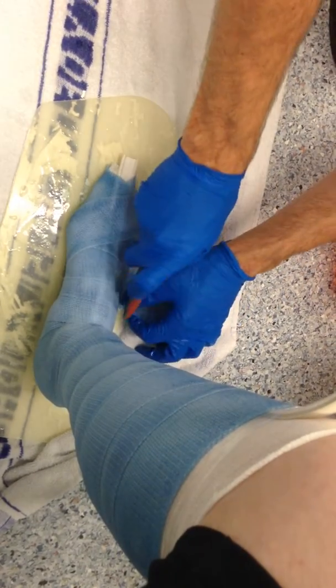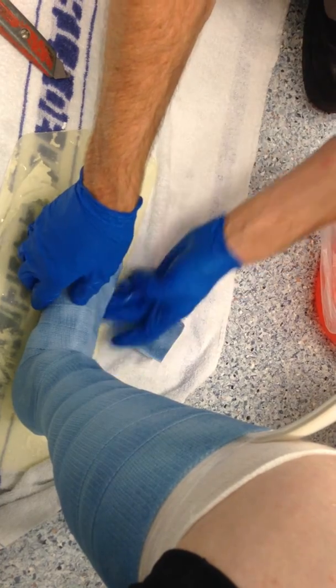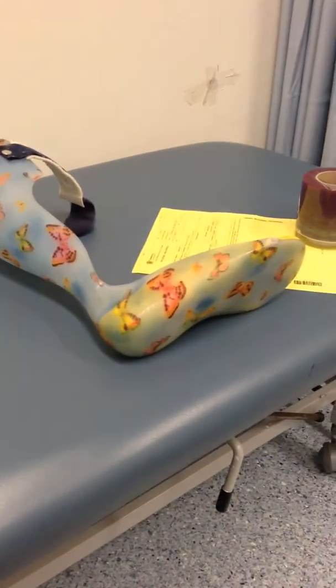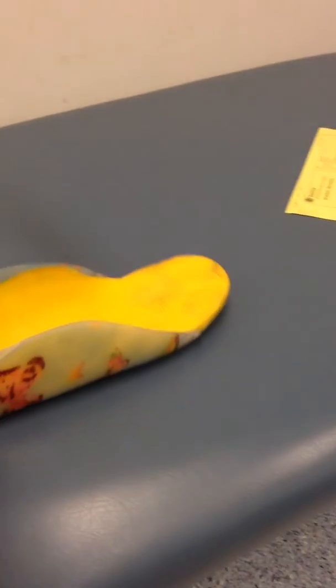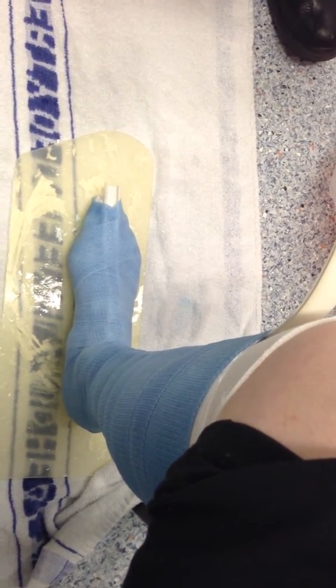Just hold that there. So this one — I don't know if we used this last time. Go right down the middle. People freak out when they see the blade — they're like, what are you doing? I still want my leg! Everyone wondering at home what I used to wear — well, this is what I'm currently wearing. The wonderful people here at orthotics at my hospital sort of made it nice and cushy for me, but it's getting a bit small and it's also rubbing in a certain area. So we're going to do another one to try and make it more comfortable.